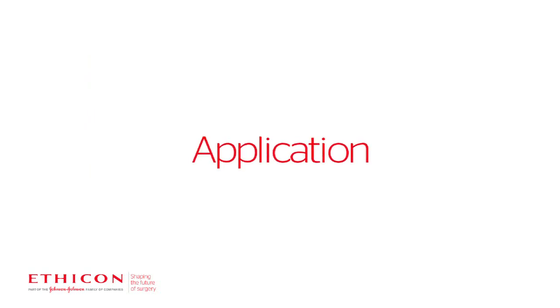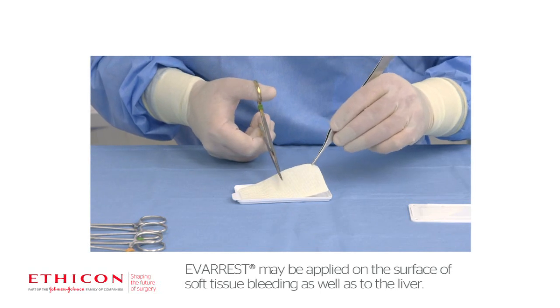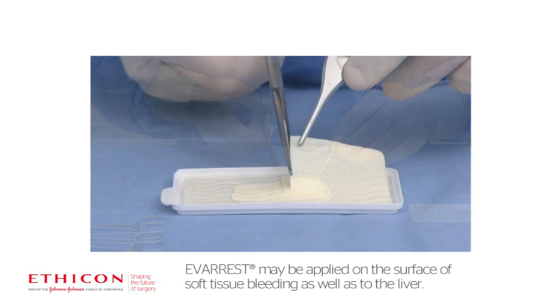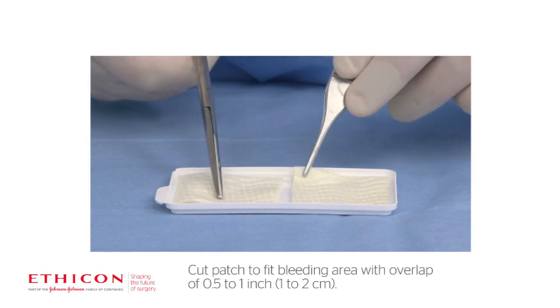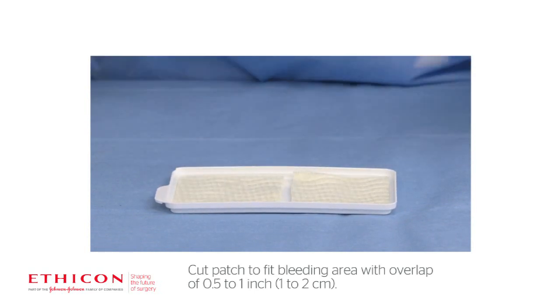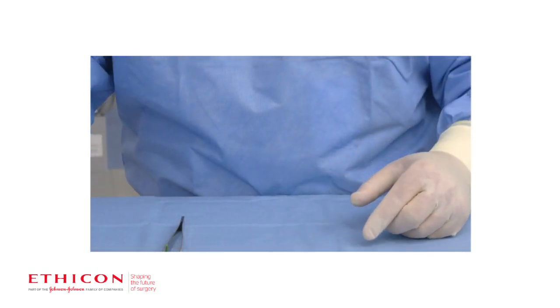Application. Everest may be applied on the surface of soft tissue bleeding, as well as to the liver. Using sterile scissors, carefully cut the patch to the size and shape needed to maintain contact with the bleeding area, with an overlap of 0.5 to 1 inch, or 1 to 2 centimeters. Keep the powdery active side facing down while in the tray.